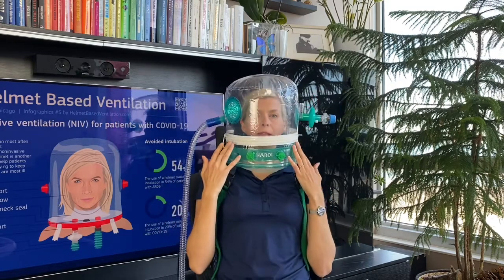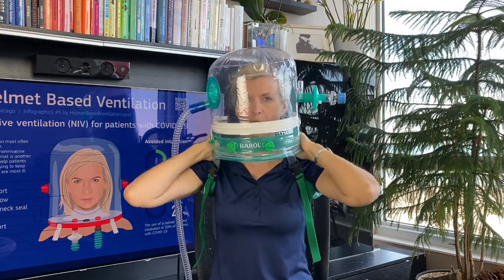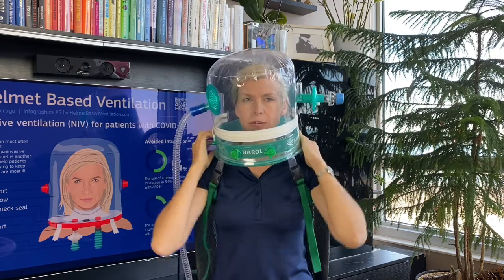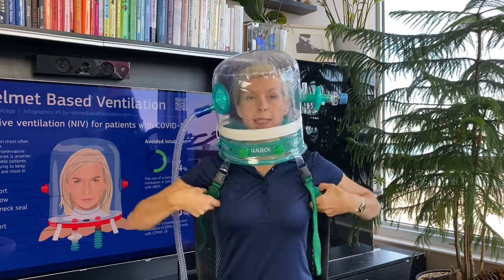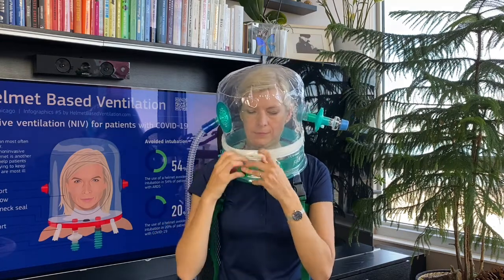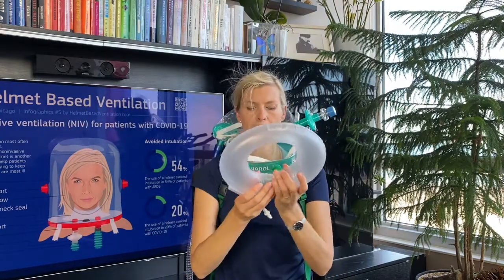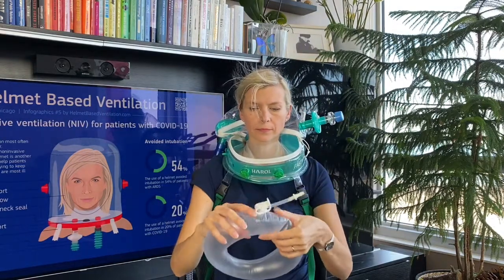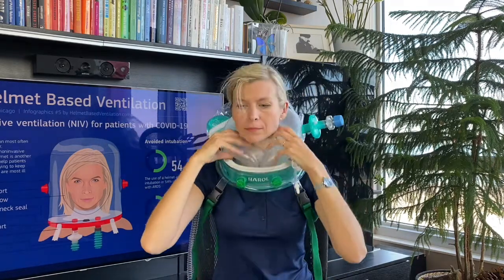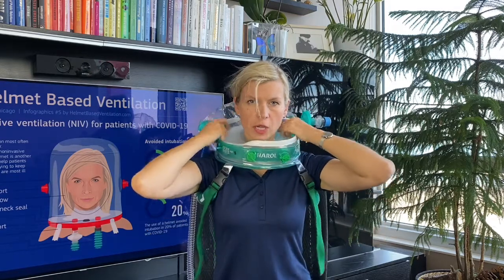When you lay back, it feels comfortable. You have to make sure the helmet doesn't press forward, because then you create an air leak at the front. Now I will put the inflatable cushion inside the helmet. The cushion is already inflated — it fits in nicely.